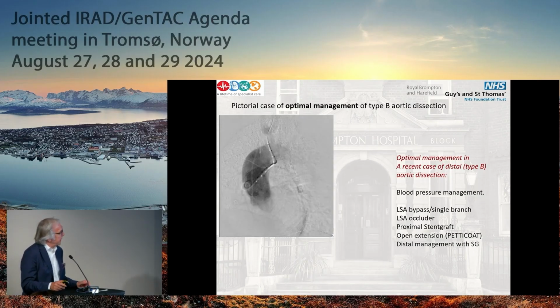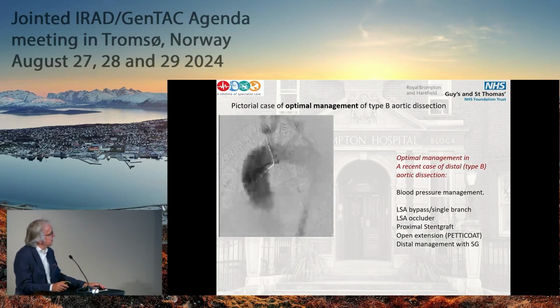Here's a pictorial case of how we treat these patients in our center. It's a patient considered to be uncomplicated with no malperfusion.